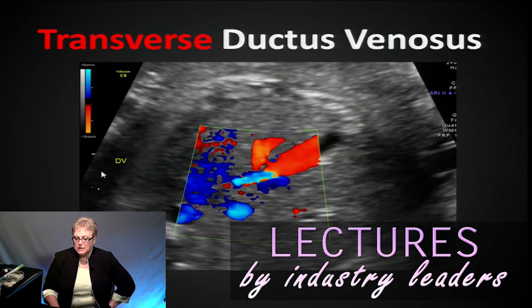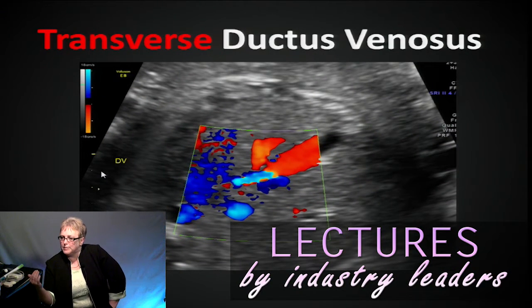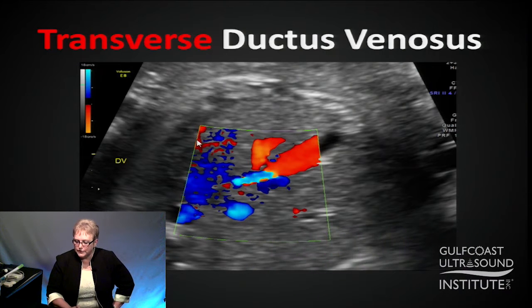One of the other things we'll look at is the ductus venosus. A lot of people have a hard time getting this. You'll see I've purposefully turned up my color gains and decreased the PRF so that I can have a little aliasing here, because if you're looking at the umbilical vein, that's going to be the area of the ductus venosus. So just turn up your gains — it's not pretty color-wise, but it's telling you exactly where to put your gate for your spectral analysis.